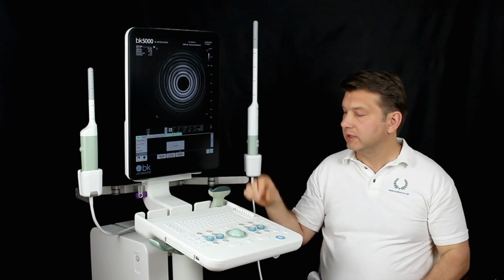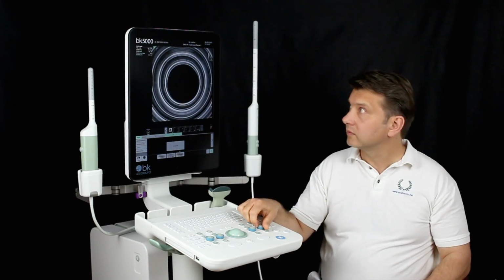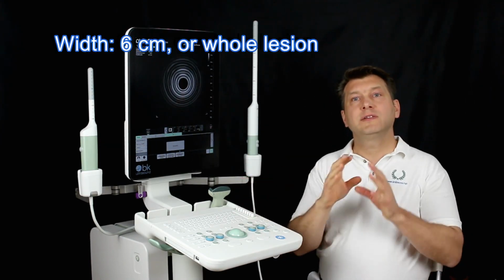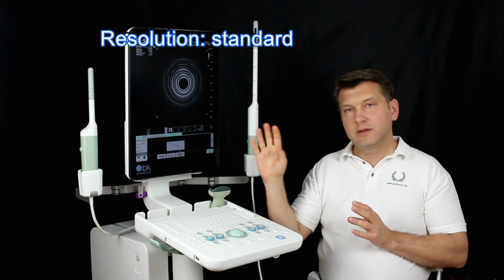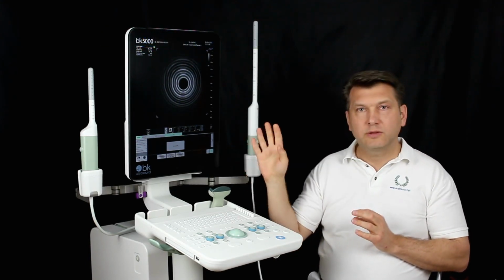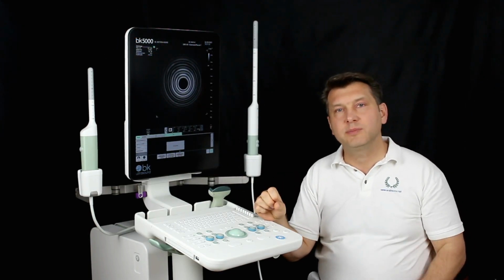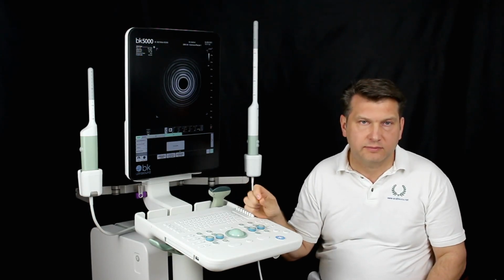Depth approximately 7 cm. Width, if possible, 6 cm or complete lesion. Resolution stays in the standard position. Distance 0.2 mm as low as possible. Time 60 to 120 seconds.